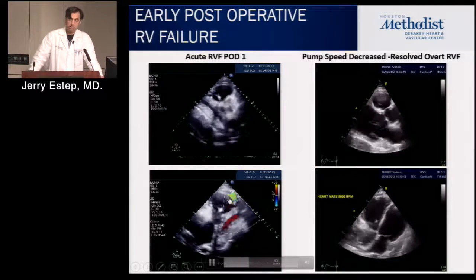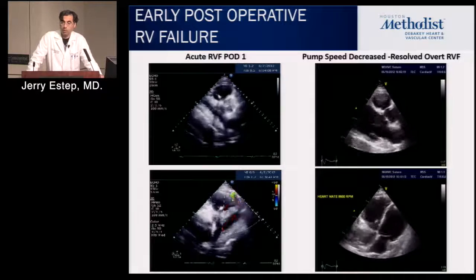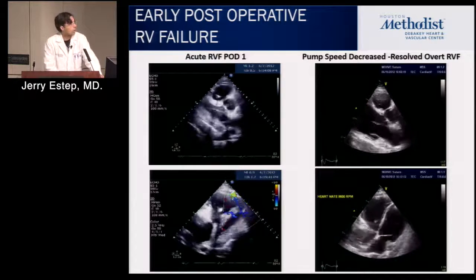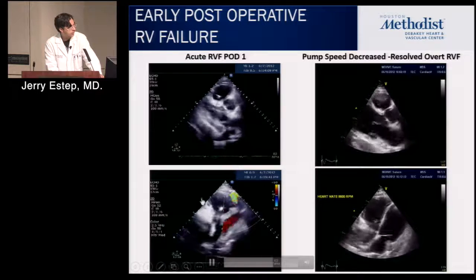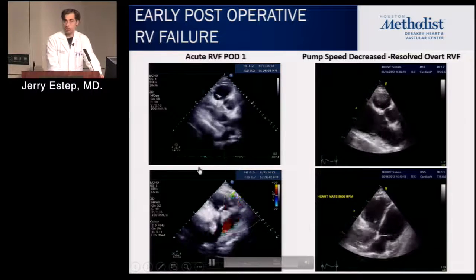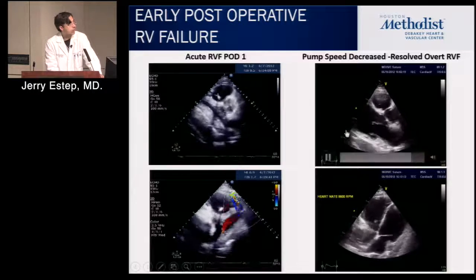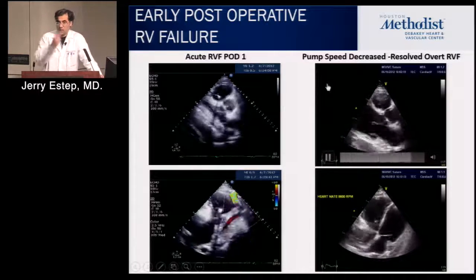Now, I can tell you, we looked at echo surrogates of RV function or dysfunction on the front end in terms of predicting the need for unplanned RVAD, which is the hardest outcome for LVAD in terms of RV failure. And the majority of our patients go into this procedure with depressed RV function and a dilated RV. But when you're seeing the interatrial septum bowing over into the LA because of a high right atrial pressure, a very dilated RV, and an LV that's underfilled, this is overt. So in this particular patient, we had to open up the chest and implement nitric oxide. We had strong consideration for using an RVAD, but by aggressive medical interventions, we were able to make this configuration into a workable scenario for this patient who ended up living an additional 2 years.